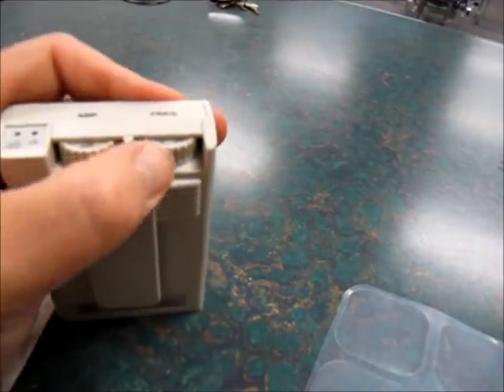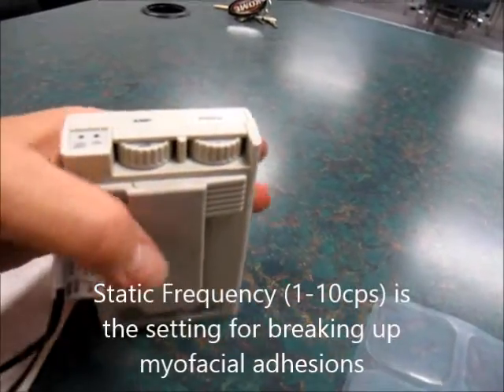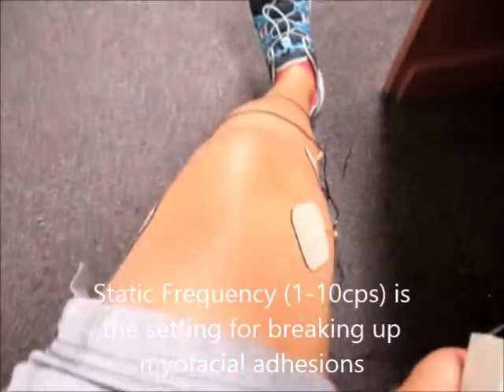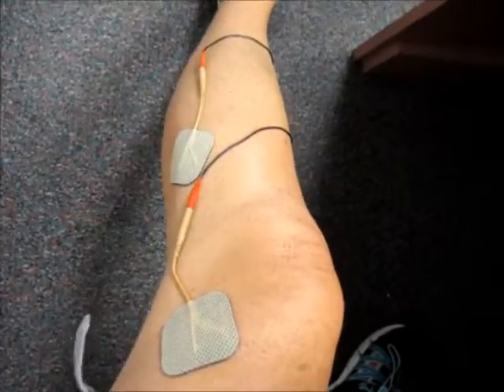I'm going to turn this so that it goes all the way down to just a myofascial adhesion setup. Now I'm going to turn this on on this knee right here. Here is the unit, and you can see the pads have been set up in a quad polar setup.